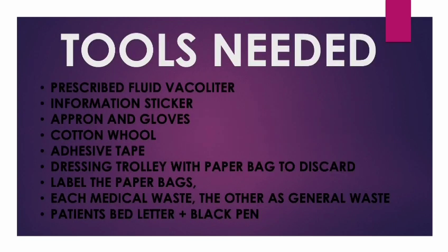Tools you are going to need to proceed with this procedure include the prescribed fluid vacolitre, and an information sticker where you will be able to write the name of the patient, registration number, the date that the vacolitre was put up, the time, and the expiry date.